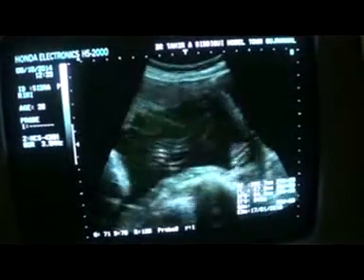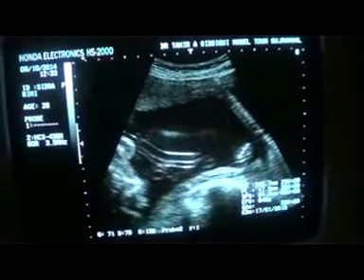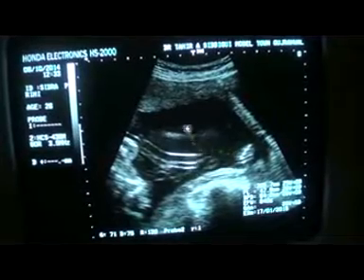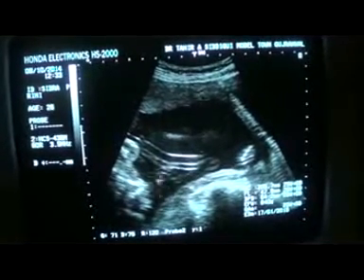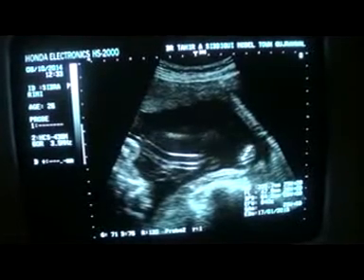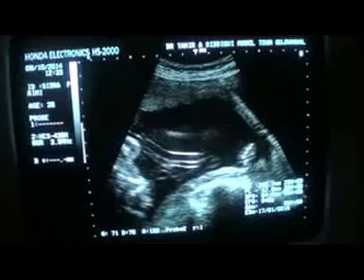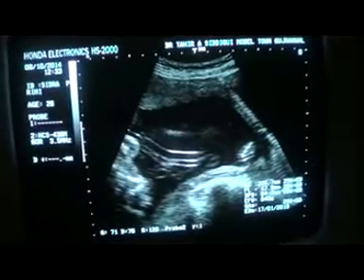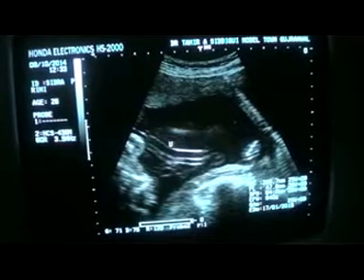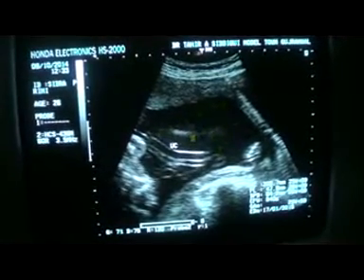So in this particular case, you see this segment of the umbilical cord, and this is the umbilical cord, and this is the lower segment of the uterus, and the umbilical cord is entering into it. Now these are the foot fingers. Count 1, 2, 3, 4, and 5. This is the thumb. So two areas are seen within this dilated lower segment of the uterus.